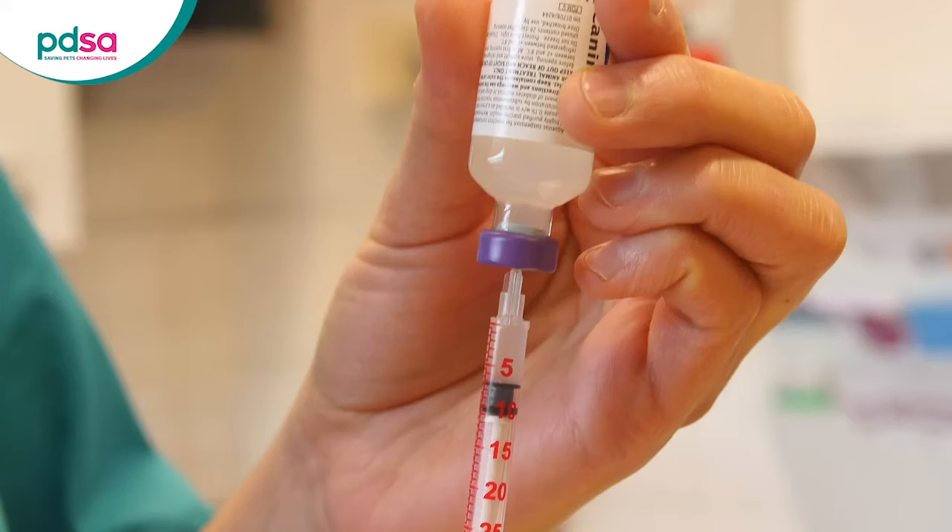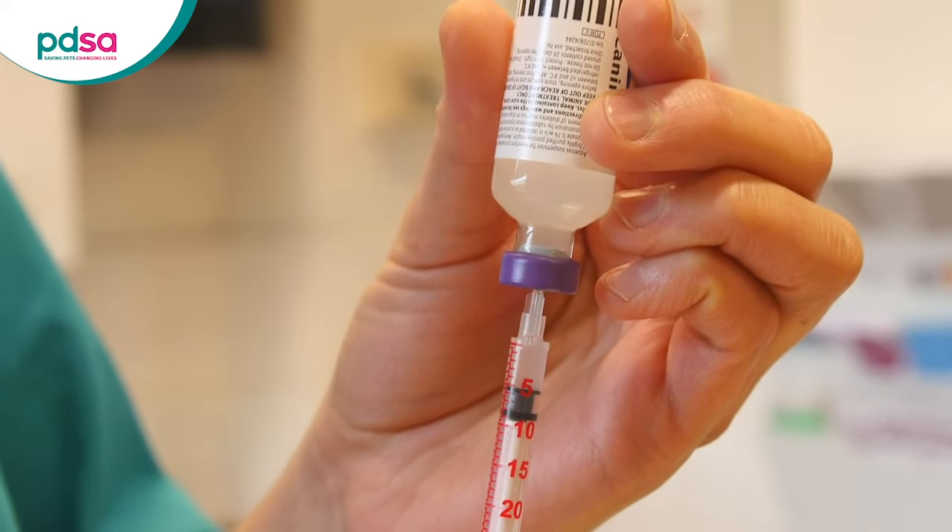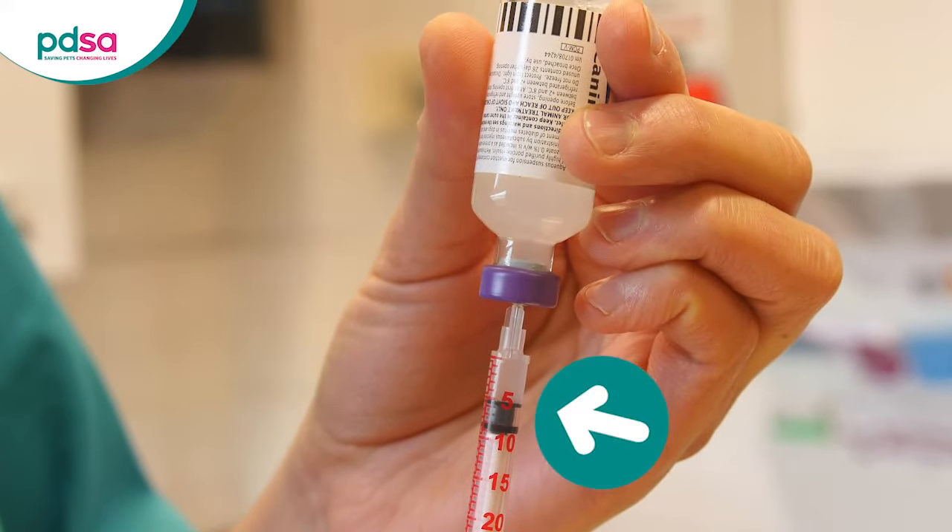Push the plunger very carefully to get rid of any bubbles from the syringe. Make sure the top of the black part of the plunger lines up with the number of units that your pet needs — so in this case it's five. If you haven't got quite enough in the syringe then repeat the process of drawing more into it and getting rid of the air bubbles.